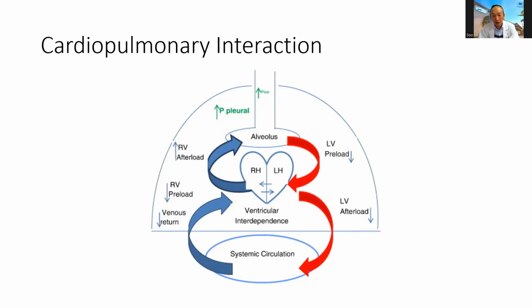As for a Glenn patient who ends up with ARDS, then it is very difficult. Because with Glenn shunt patients, if you put a lot of pressure in the lungs, you'll find that the head becomes congested. You can literally see the veins in the neck become engorged if you have a patient with a Glenn shunt who has very high ventilating pressures. So this group of patients has a very poor prognosis. Let's say this single ventricle patient ends up with severe pneumonia ARDS, they may not make it.